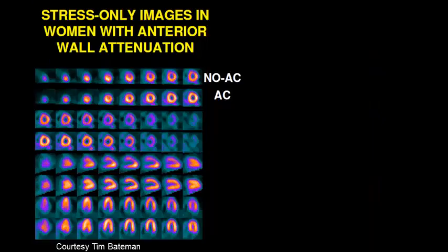I think stress attenuation correction does allow you to do more stress-only imaging. So with attenuation correction, you potentially end up giving the patient overall less radiation.